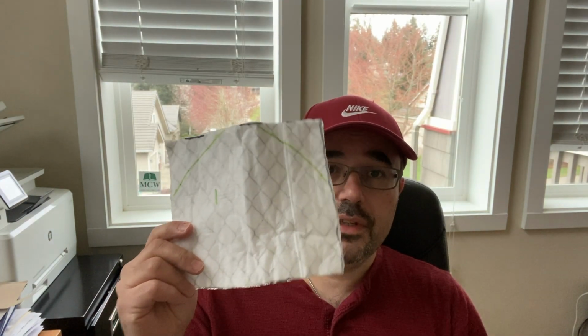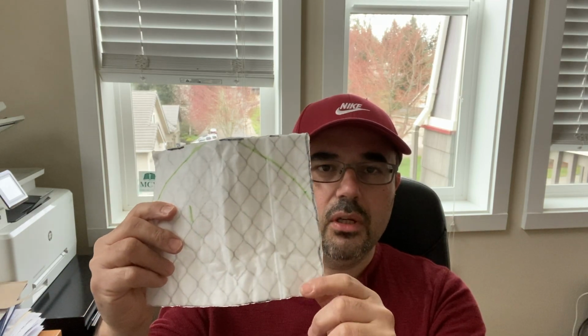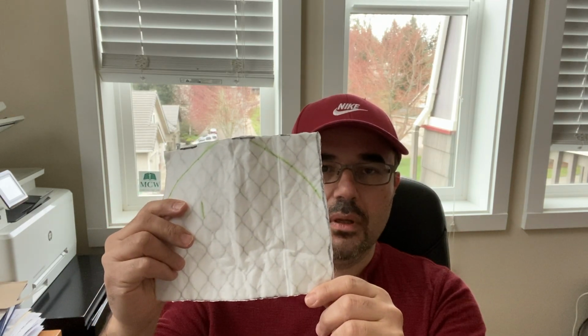All right. Okay, step 1 is, what I recommend is that you cut out just a single piece of your filter. I would recommend for the first one that you cut out a 7 by 7 inch piece of the filter.